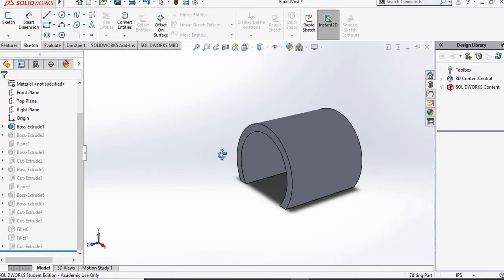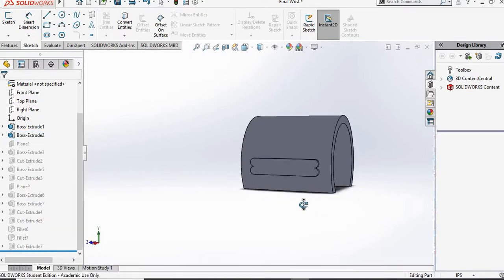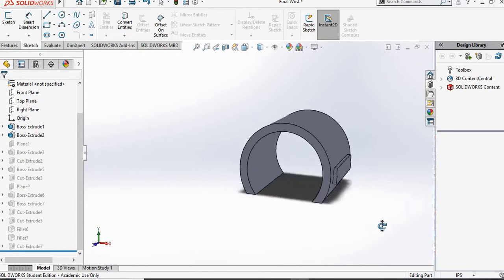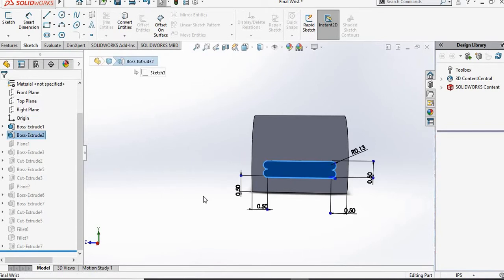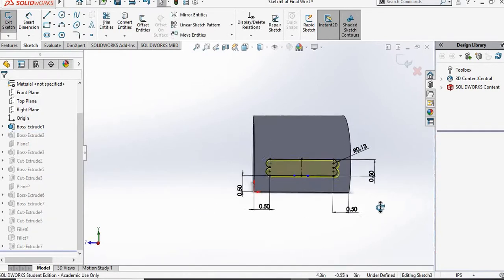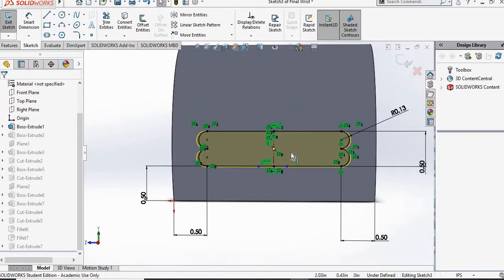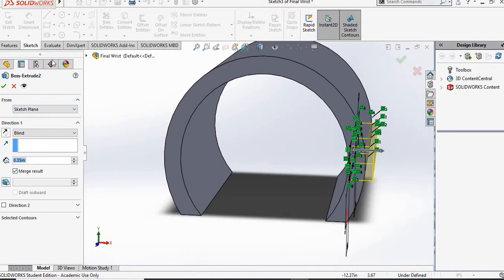So after we made that cut, we went ahead and created these secondary cuts so that we can insert our Velcro strap. So here's a sketch, and here are the dimensions. These are basically 2 lines, parallel lines, equal length as well as 4 arcs here. After I created this sketch, I went ahead and extruded it 0.35 inches.